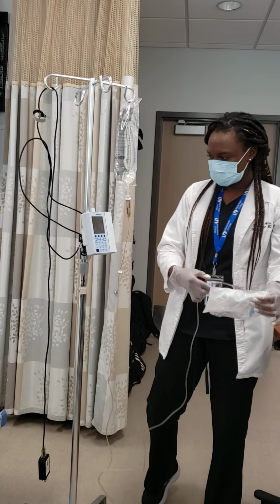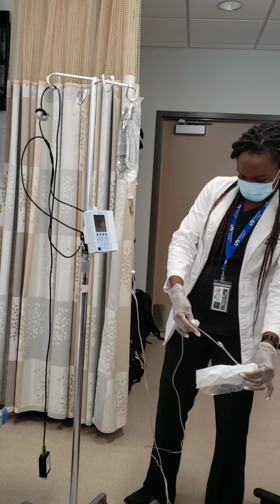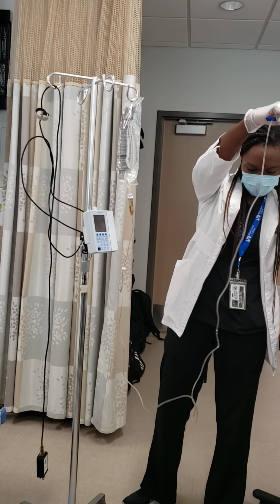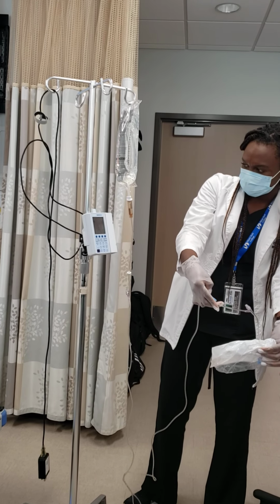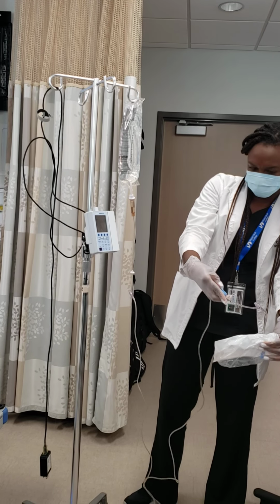Okay. So now you can see it with the dripping, and you have to watch the line because you have to make sure that all of the air bubbles are now out. So now you can go ahead and continue. Okay, you see it dripping, right?